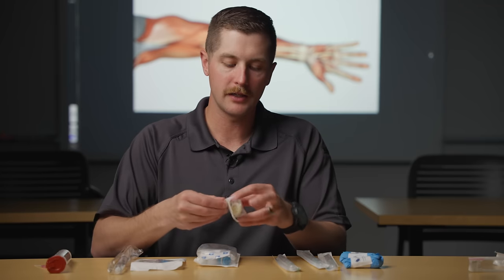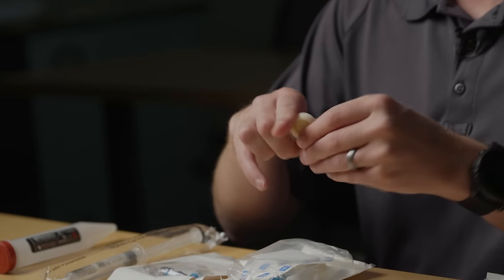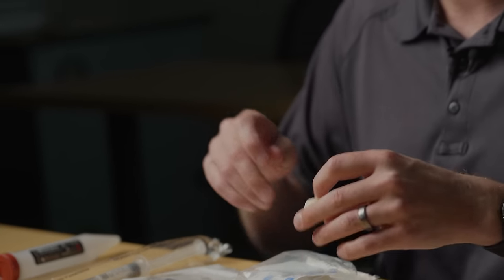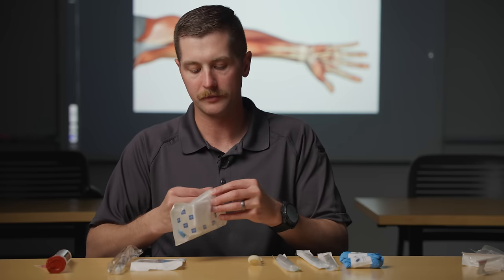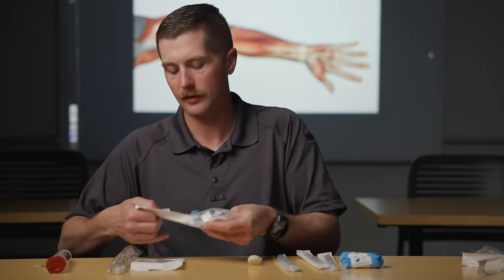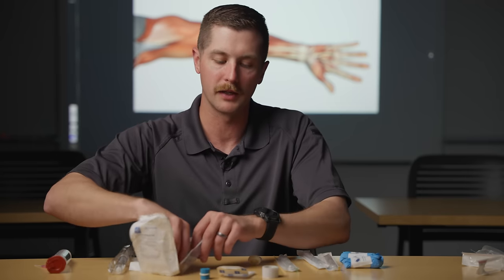As we look at the chlorhexidine, there are a bunch of different brands. You crack it and it allows you to clean the site with aseptic technique. Then we've got our start kit, which has everything you need to get the ball rolling as far as securing that IV and prepping it.